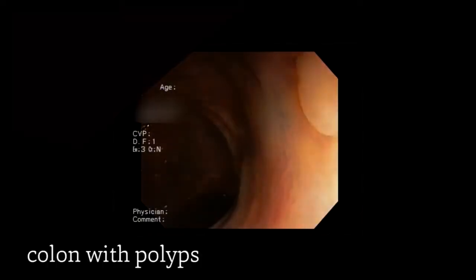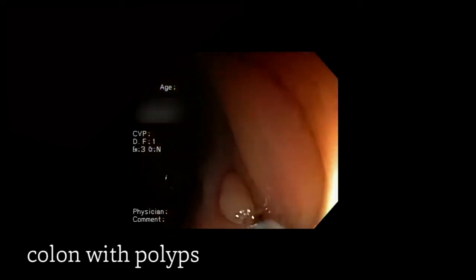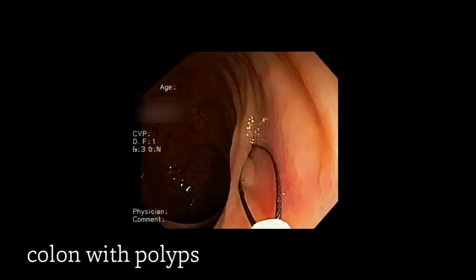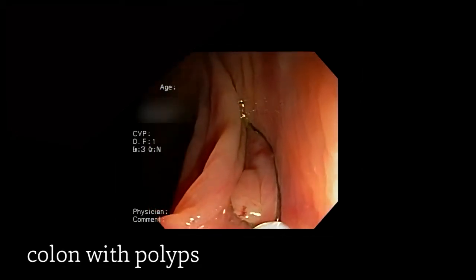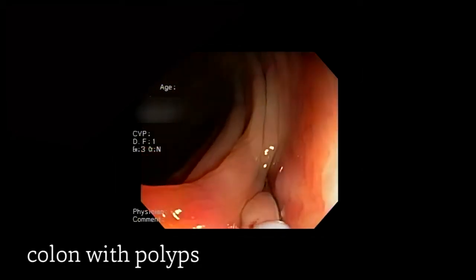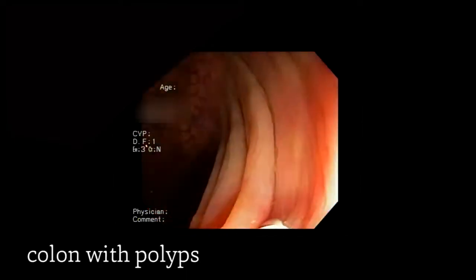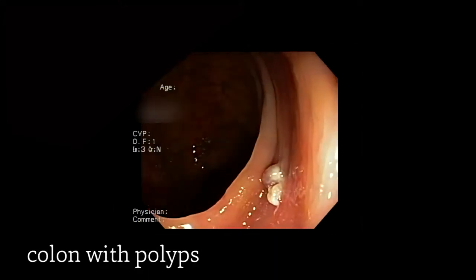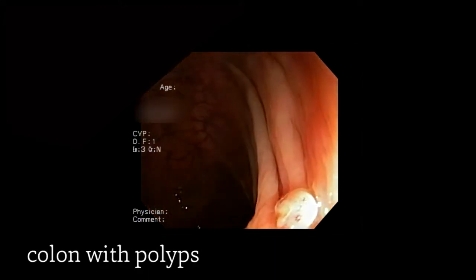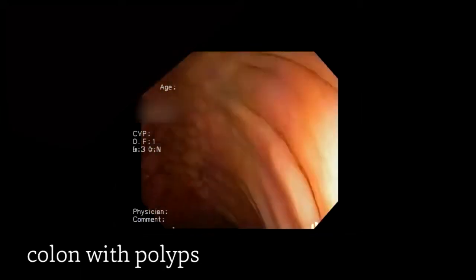Now let's look at a different patient. What you'll notice in this patient, as opposed to the last patient, is that on withdrawal we're encountering polyps. We're using different techniques to remove polyps. What you're seeing here is we're using a snare — a device that is like a wire, or a lasso, in which we put a loop around the polyp and remove it, either removing the polyp cold or using heat or cautery to remove the polyp.